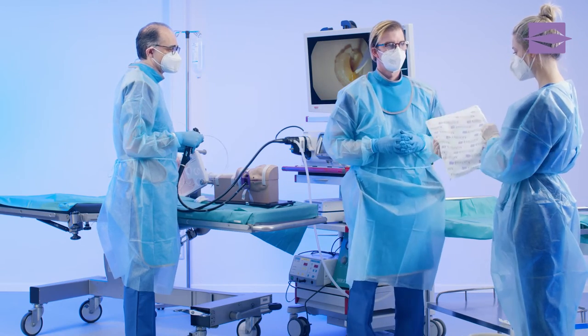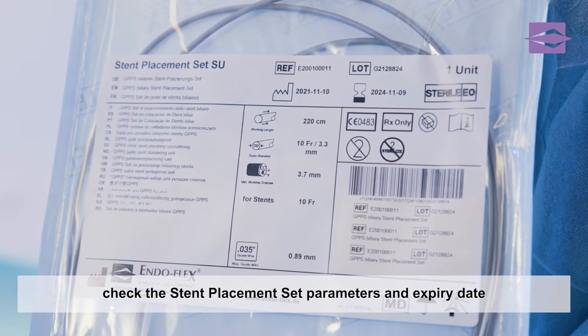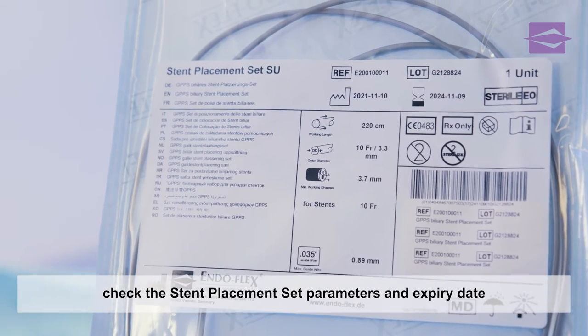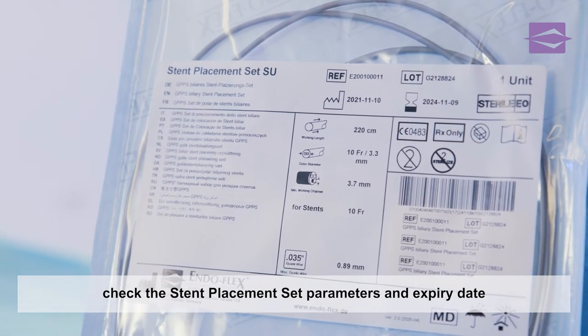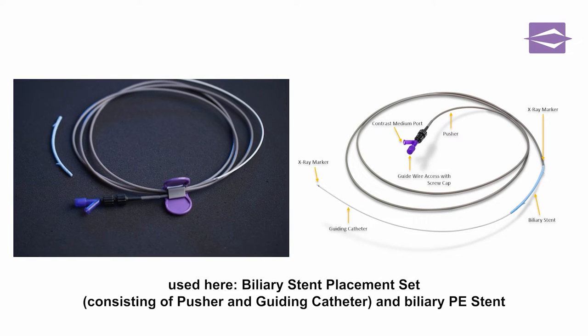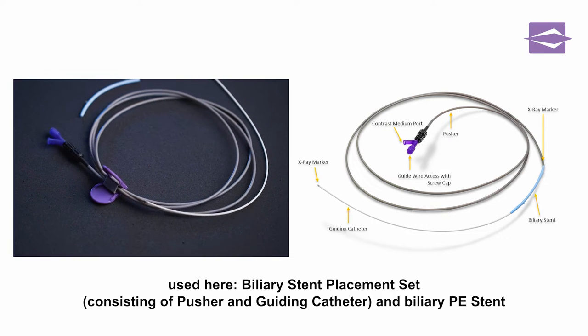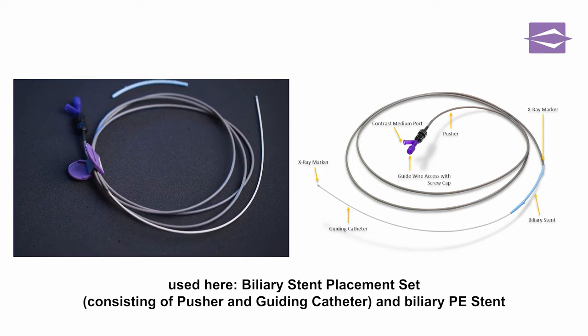At the beginning, the assistant is handed a stent placement set that matches the stent. The relevant dimensions and the sterility expiry date are compared with the label. The stent placement set provided consists of a pusher and a guiding catheter. The dimensions of the enclosed polyethylene stent can be selected individually.